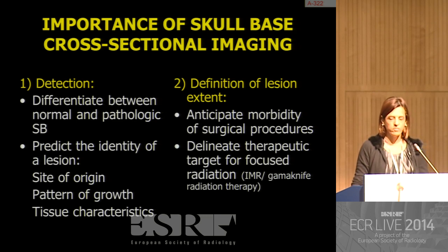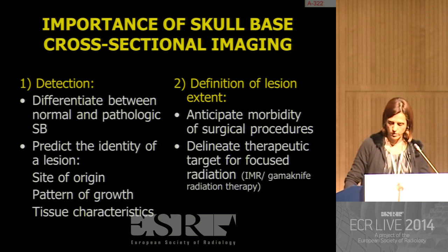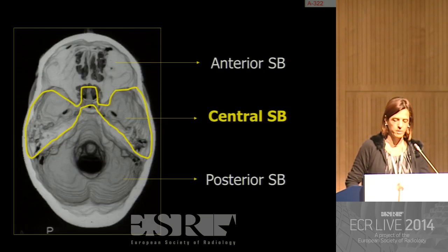Imaging is therefore very important in the detection and in the prediction of the identity of skull-base lesions according to their site of origin, their pattern of growth, and their tissue characteristics, as well as in the definition of the lesion extent. And this allows treatment planning and treatment choice, mainly anticipating the morbidity of surgical procedures and also in the delineation of the targets for radiation therapy.